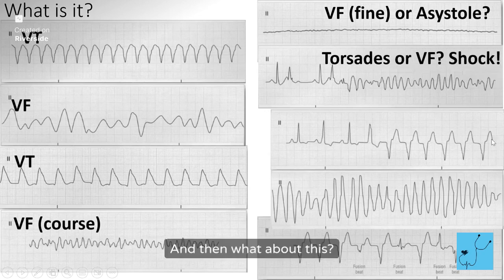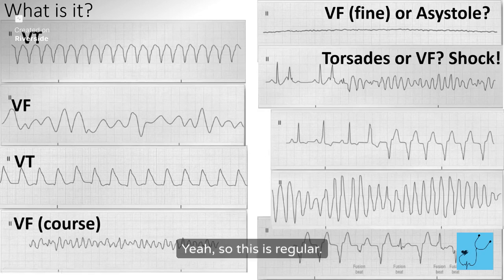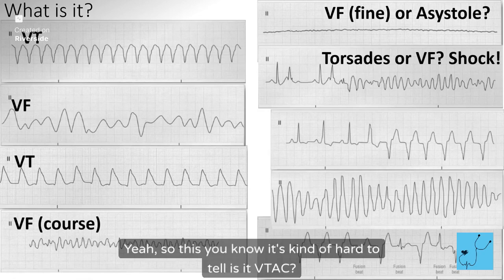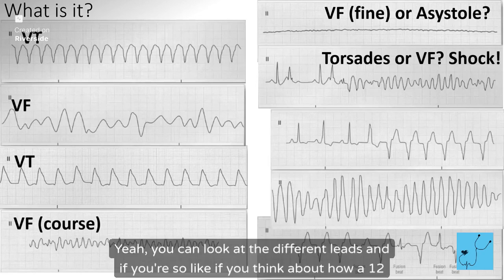And then what about this? Yeah, so this is regular. This is kind of hard to tell. Is it VTAC? Is it SVT? Yeah, you can look at the different leads.